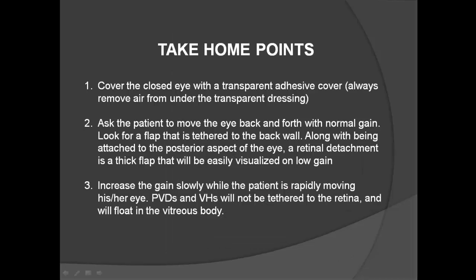So just some take-home points. Make sure that you cover the closed eye with that transparent adhesive. Tegaderm works beautifully. I know sometimes you may get a little freaked out that the Tegaderm may pull some eyebrow hair off or some eyelashes. It really doesn't. You don't have to worry about that. But make sure that you remove all the air from under the Tegaderm in order to decrease the chance that you'll have real difficulty viewing your ultrasound screen because there's air obstructing your view.